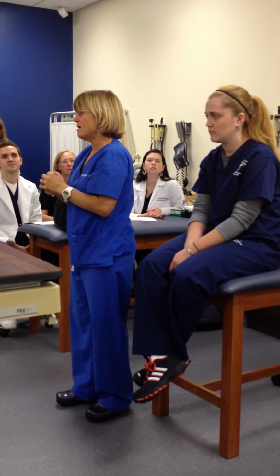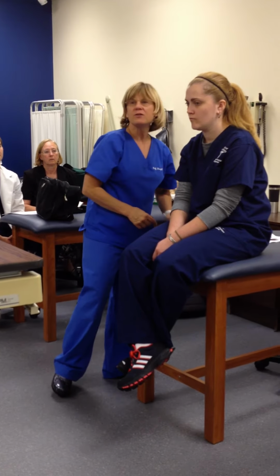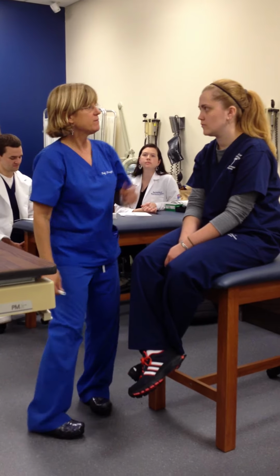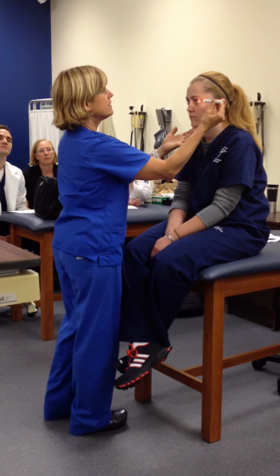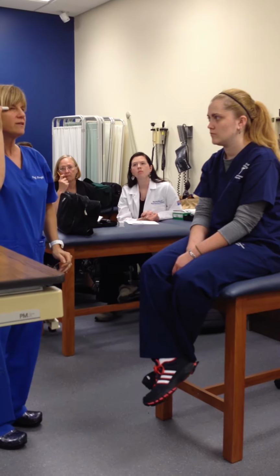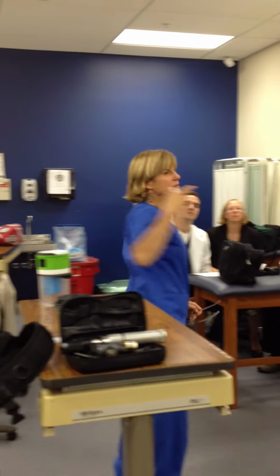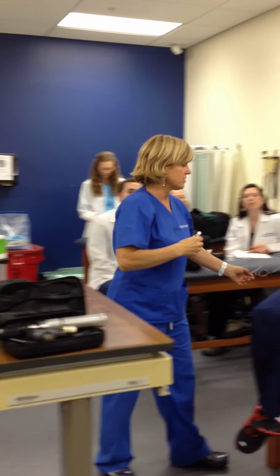And then we are going to do the anterior chamber depth, and on anterior chamber depth, just go ahead and look straight forward, and this is where I'm going to shine my light in, and I'm going to shine it right on one side. This needs to come directly from the side so that you're shining it right through the anterior chamber as if you're heading practically for the nose or the other side of the forehead.